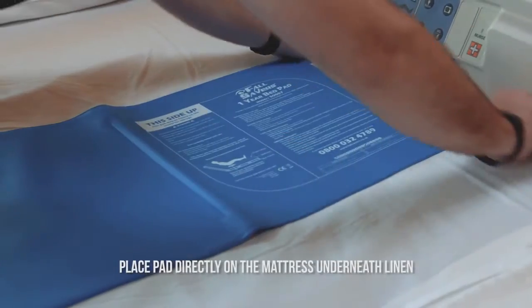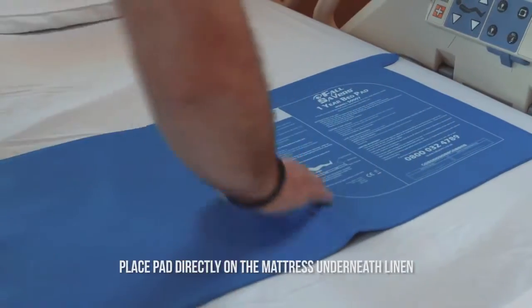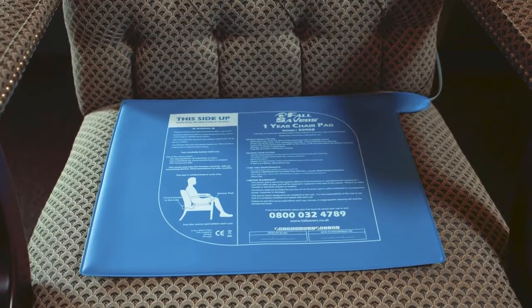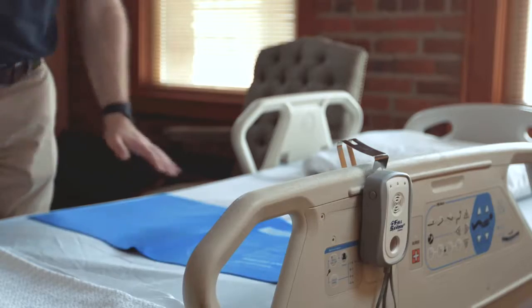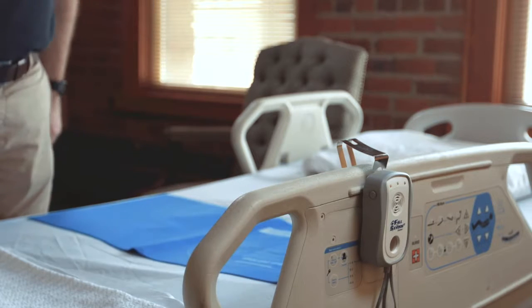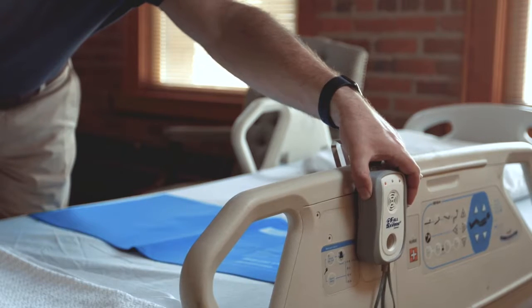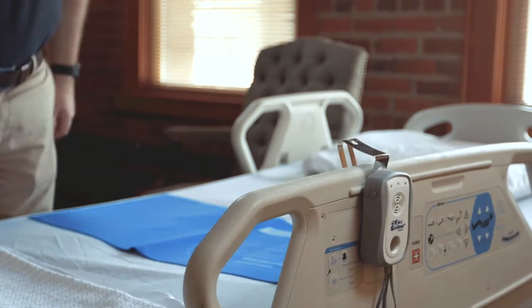Place the bed sensor pad on top of the mattress horizontally across the width of the mattress just beneath the lower back, or chair sensor pad in the center of the seat. To test, apply and hold pressure on the sensor pad and release after a few seconds. An alarm should sound and the red alarm light should flash periodically on the front of the FallSavers Connect monitor. Press the hold button for 2 seconds to reset.